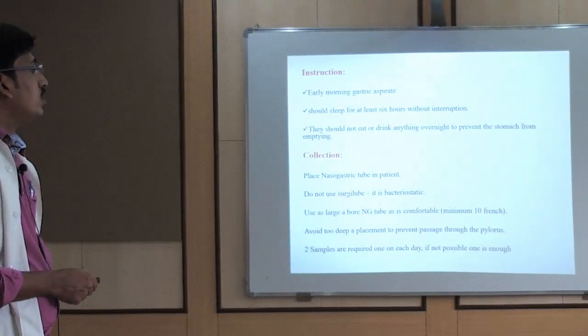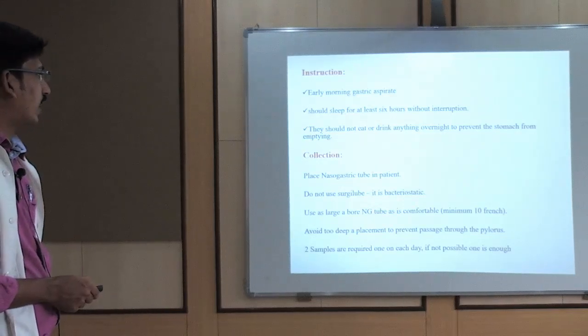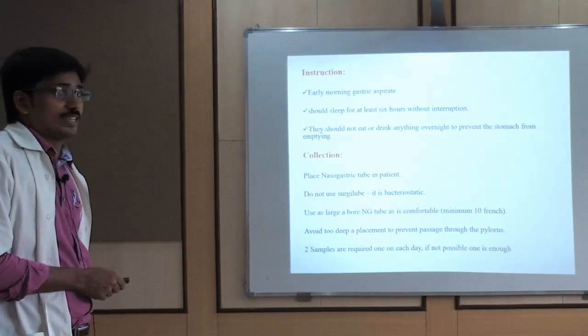Don't use any surgical lubricant, because it is bacteriostatic and will kill the bacteria, and mostly we would then give a negative report only. Use a large bore nasogastric tube, don't use small size tubes.